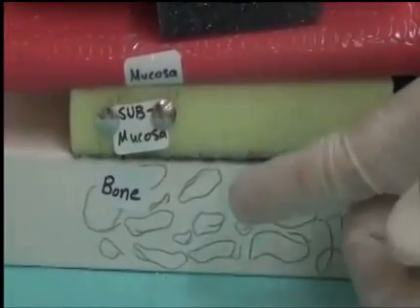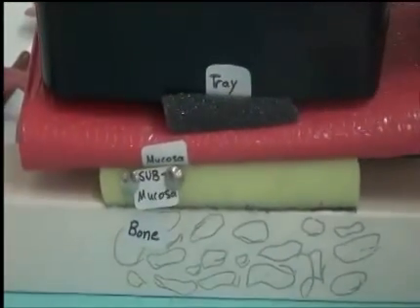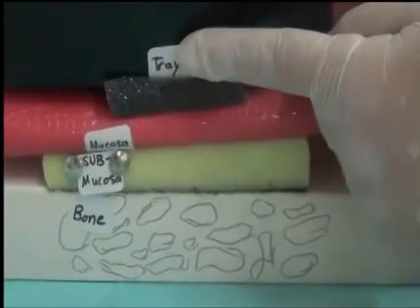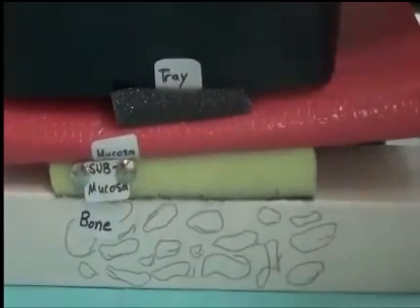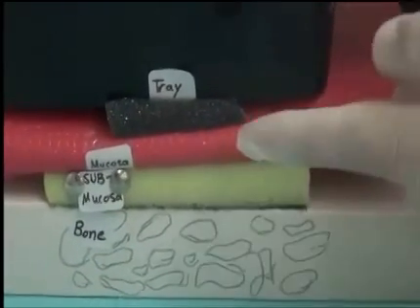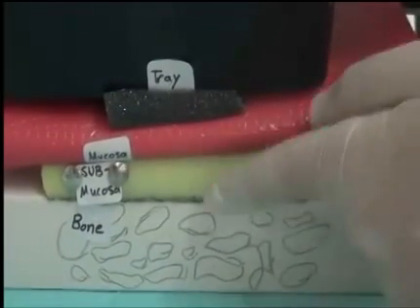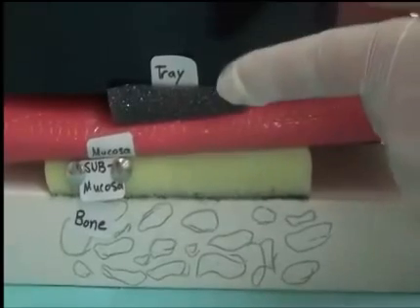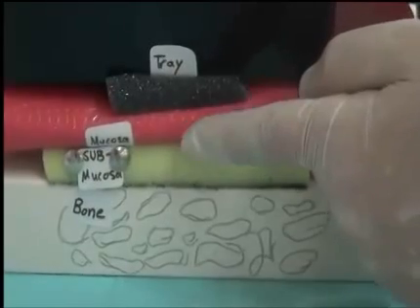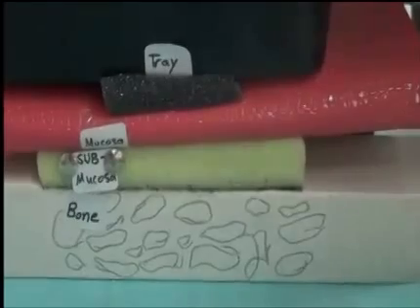So if the mucosa, impression material, and the tray are pressed all together, this is called a mucocompressive impression, and the status of the tray is closely fit to the mucosa before adding the impression material. And the tissue underneath is compressed. So that's why we call it the tissue compression method. This can be done with a tray that has no spacer in that area. The impression material is squeezed between the tray and the mucosa. The mucosa has some compressibility, and the bone itself can withstand such pressure.